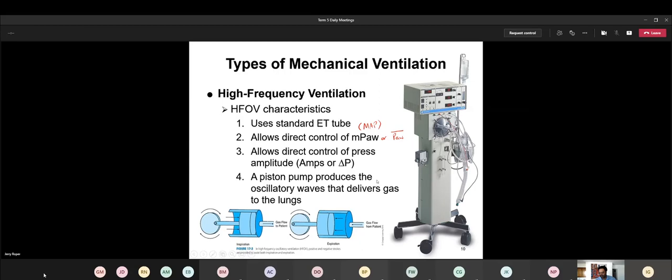and I guess while I'm here, I mentioned that I was looking at the knob here and I said, well, this has got to be the 3100A model versus the 3100B. The 3100A is going to be reserved. The company that makes this machine publishes their patient requirements, saying that if you have a patient less than 35 kilograms, then the 3100A is going to work out just fine. But if they're larger than 35 kilograms, the 3100A is no longer going to be effective, because you're going to have to go to the B model.